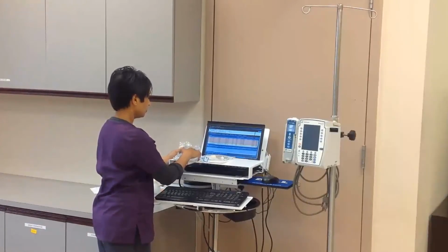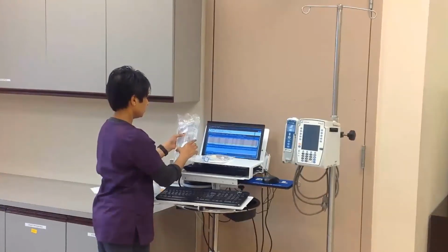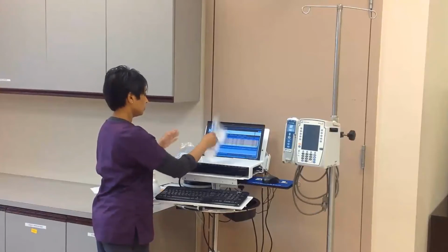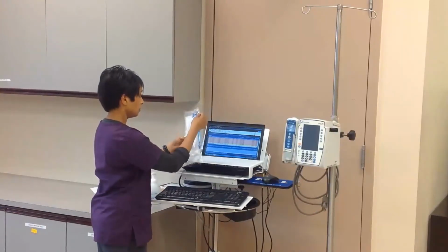Nursing responsibilities include the reason, which is to provide the patient hydration. Assessments include checking the patient's blood pressure, pulse, and auscultating lung sounds for any crackles in the bases. Check the expiration date and integrity of the primary IV tubing package. Open using the perforated edge and carefully remove from package.